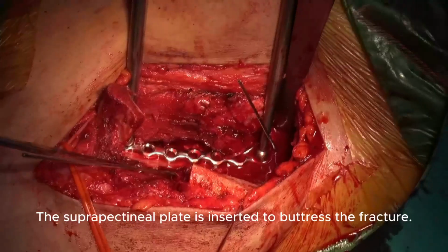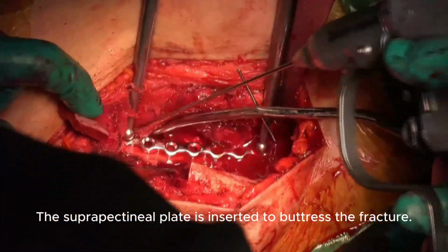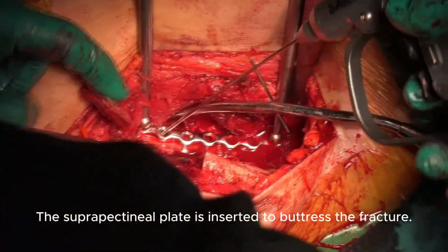The suprapectineal plate is inserted to buttress the fracture.